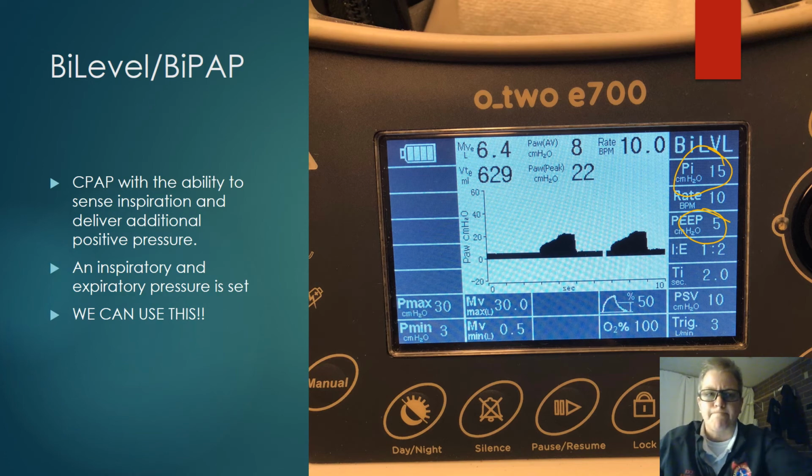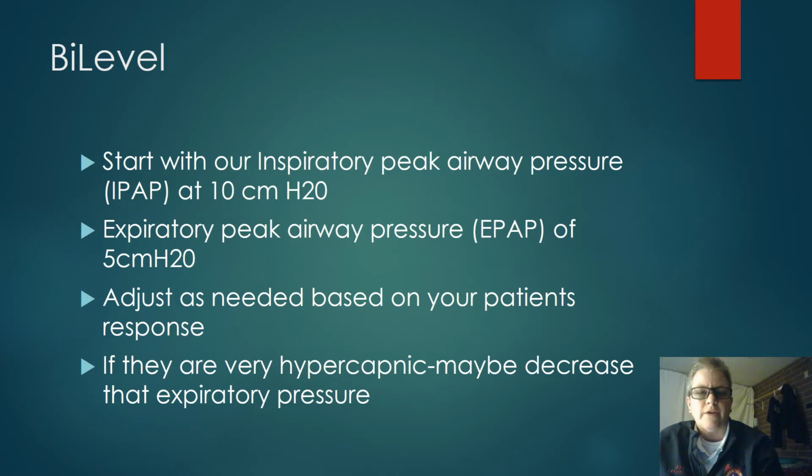Okay, this is just what we talked about on that bilevel. Start with our inspiratory peak airway pressure, that IPAP, at 10 centimeters of water pressure, that expiratory peak airway pressure, or EPAP, of 5, just like we've been doing. Adjust as needed based on your patient's response, whether they can tolerate it or not, or need some more assist or not. If they're really hypercapnic, maybe decrease that expiratory pressure a bit, okay?